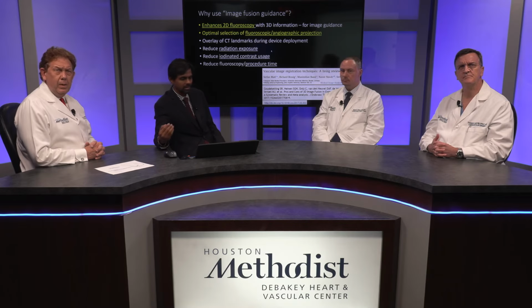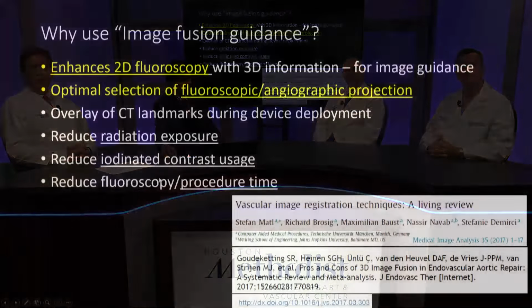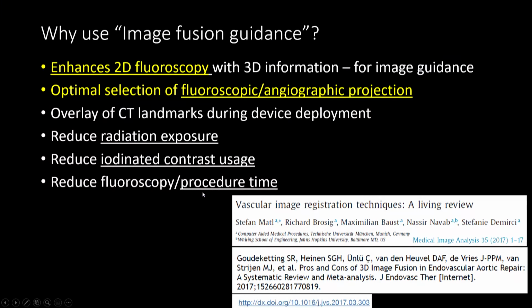Okay, so I think this is kind of my take-home message. So why do this, right? There are enough publications out there that it reduces radiation, reduces contrast, reduces fluoroscopy, potentially procedural time. But this is one of those things that people most often think is nice to have, but let me just go ahead and do this case, right? That's often the mentality.